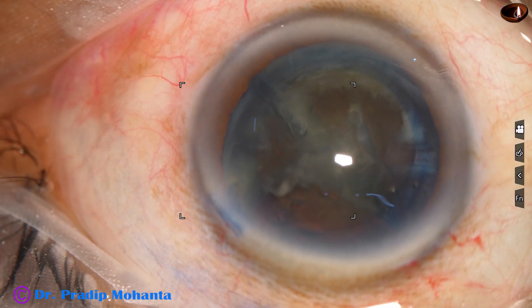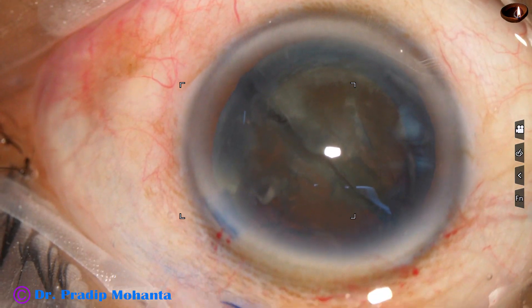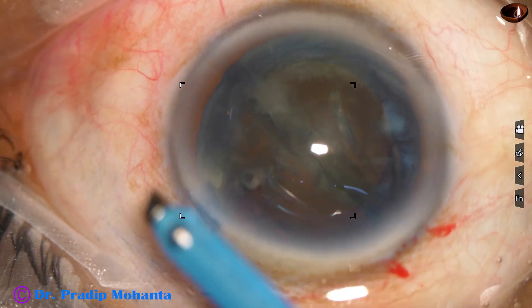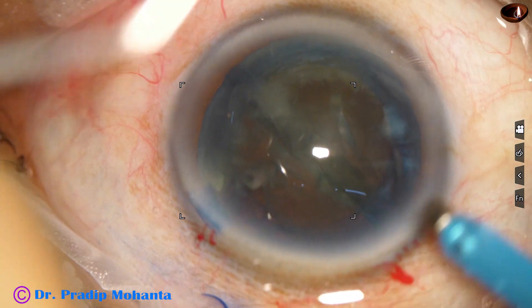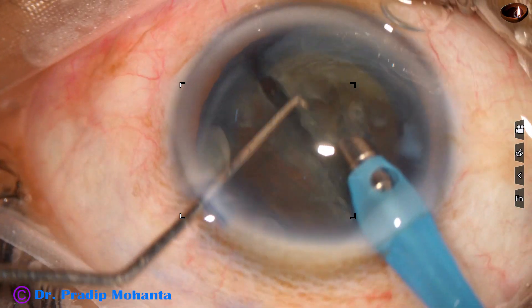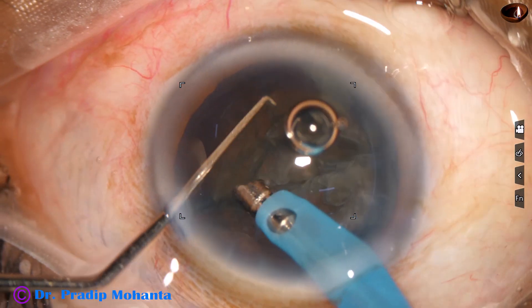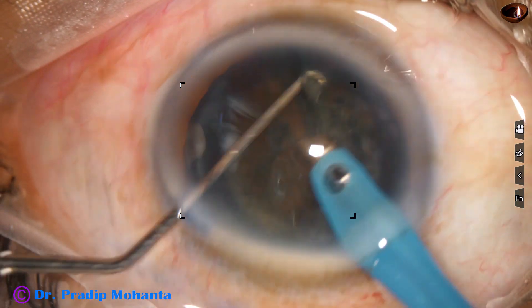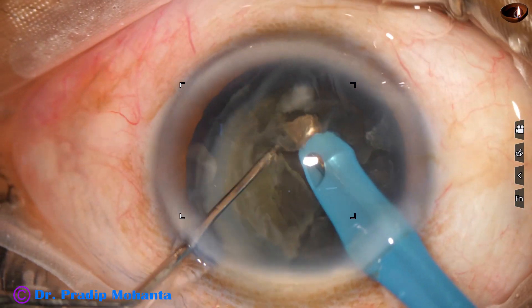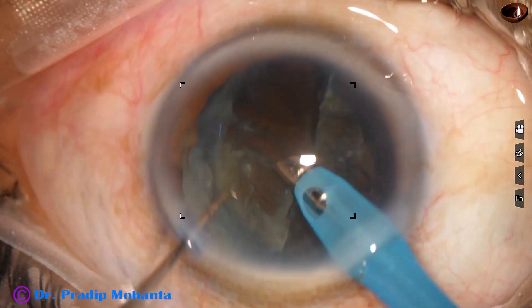Once the nucleus has been divided into two hemi-nuclei, it is easy to manage. Now the phaco needle goes in with its bevel down. Even if we fail to divide the hemi-nuclei into two pieces, we can still manage somehow. In this case, as I try to hold the hemi-nucleus, I cannot hold it properly — but still, I could manage.